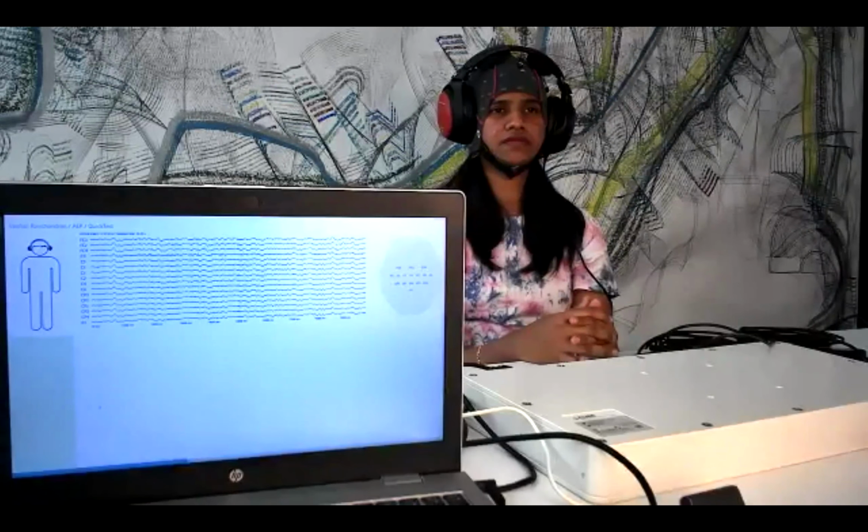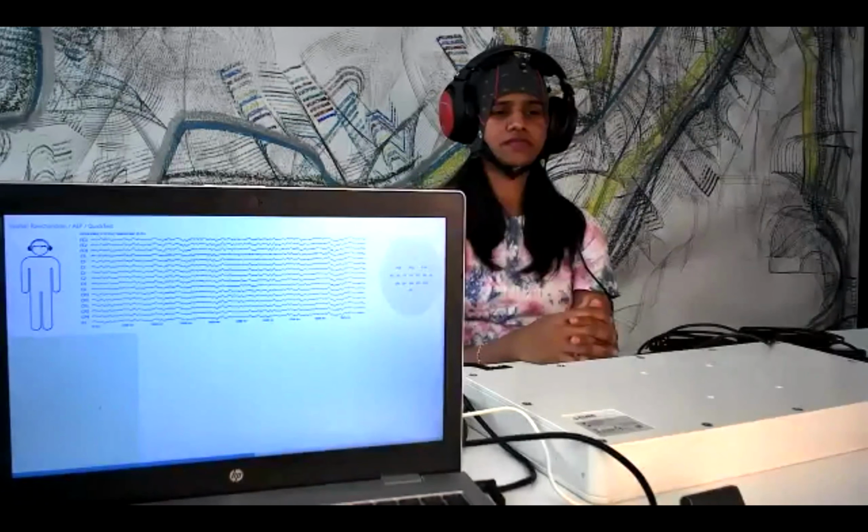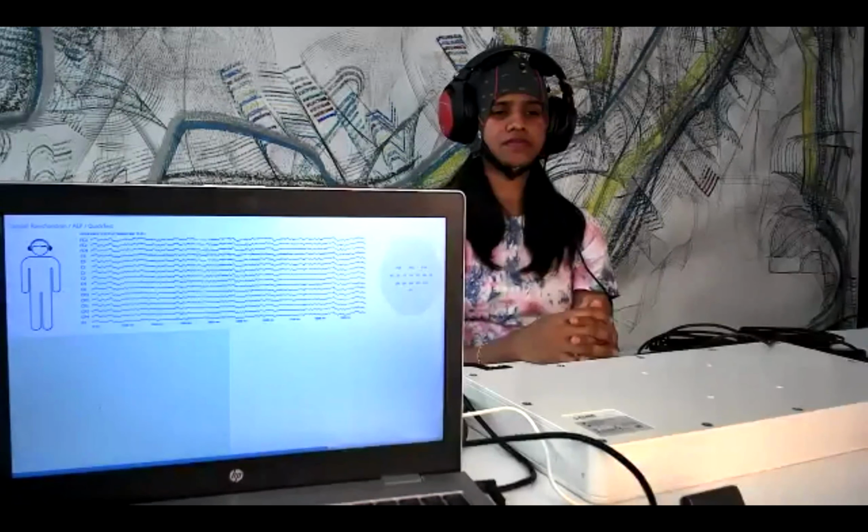And we'll see how far this moving bar will get.